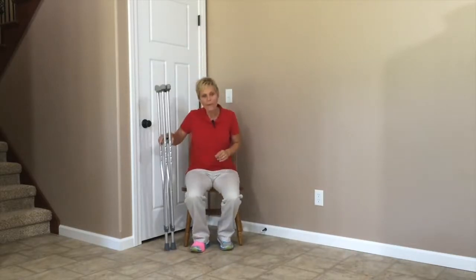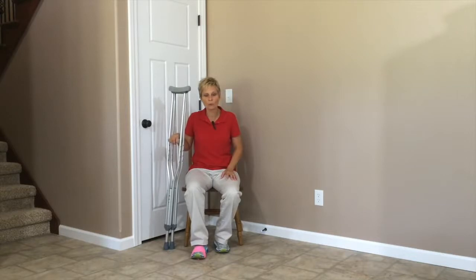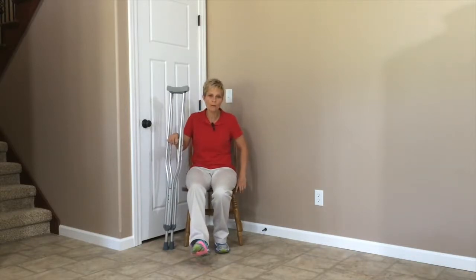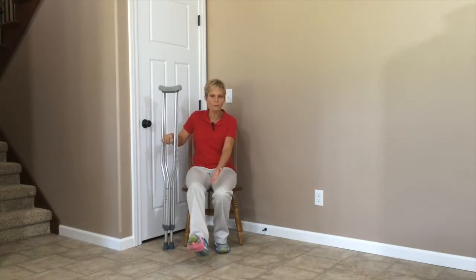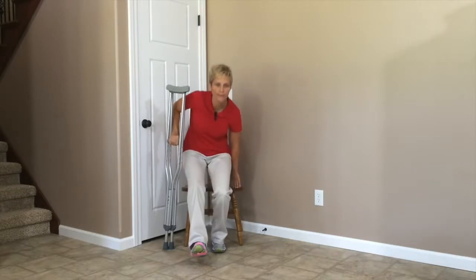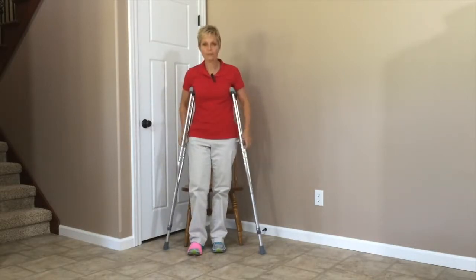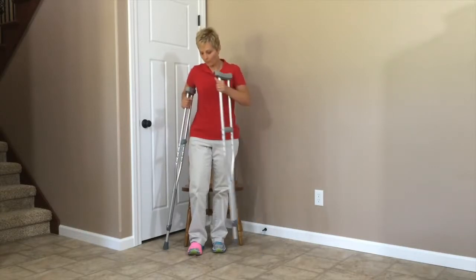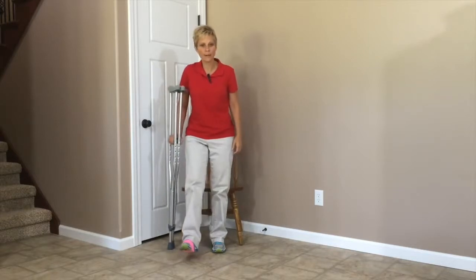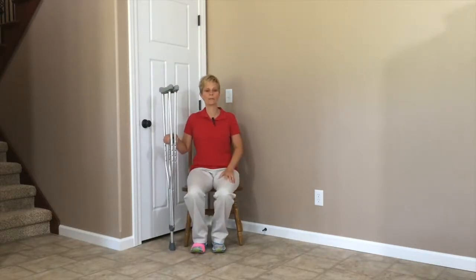I've got one here. I'm going to put my crutches on my dominant side because I feel like I have more control when getting up and pushing. You're going to push off the surface you're coming off of, with your hands on the crutches. If I have non-weight bearing here on my foot, I'm going to raise that up, lean forward, push up with the crutch, bring it over, and then begin walking. Same thing when sitting down — take the crutch back over to this side, put my hands on it, start down, reach for the surface, and have a seat.